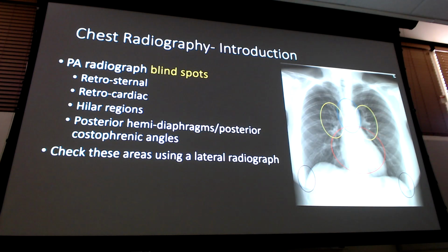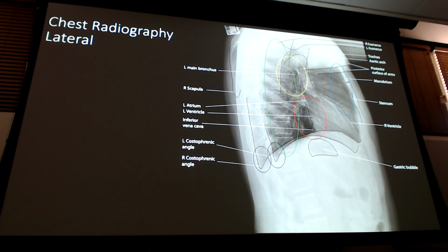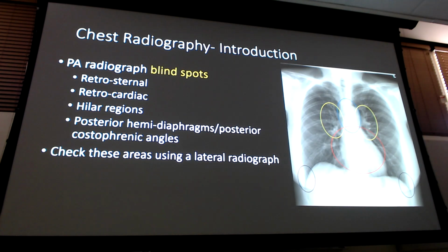If I go thoracic area in the center, I don't have a color on here, right? Because you can see the spine. This allows me a much better visualization of those thoracic vertebrae too. Right? I can really see each of them, whereas I kind of make them out on that frontal view, on that PA view, but not in the detail that I'm getting right here. And then my costophrenic angles. I can see my posterior. What you're seeing on the PA is the anterior up here. This is what we're seeing on this film. These are your anterior costophrenic angles.